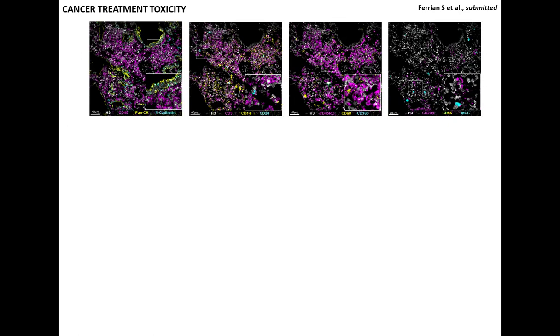Our analysis revealed a gastritis characterized by significant immune infiltration noted primarily in the lamina propria, mainly composed of T cells and to a lesser extent by macrophages and mast cells. Sparse B cells, dendritic cells, and NK cells were also noted in the lamina propria.